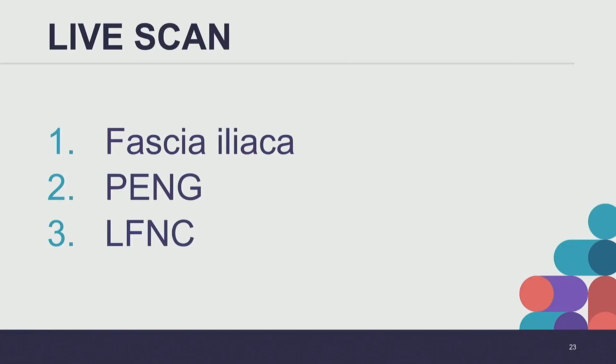The bony structures and cystic structures, right, artery, vein, tend to be pretty easy to find regardless of body habitus. Even for the suprainguinal, if I can palpate the ASIS first and then step off just medially to find that AIIS, I haven't had a problem. Literally last week we had a hip fracture patient with a BMI of 80 and we did a suprainguinal. We had to drop the depth, but I didn't need the curvilinear probe. I applied a lot of pressure and I was able to actually see that AIIS.